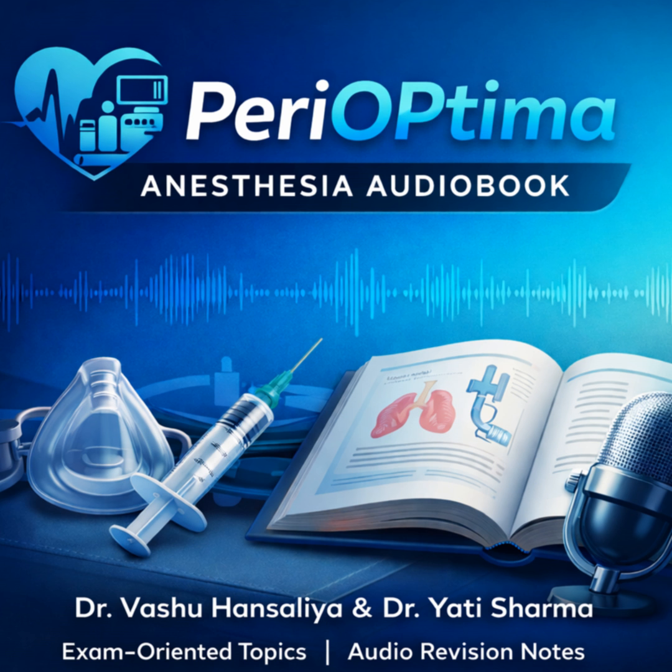And that's the chattering you mentioned. That's the chattering or kicking you'll see. The lines will shake violently. The vein is sucked down. What do you do when you see that? Give volume immediately, blood, crystalloid, whatever you have. Or you can decrease the pump speed temporarily to let the venous system refill. Do not ignore it, or you will cause massive hemolysis and risk entraining air.